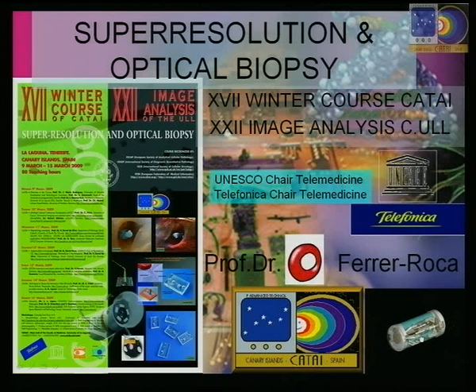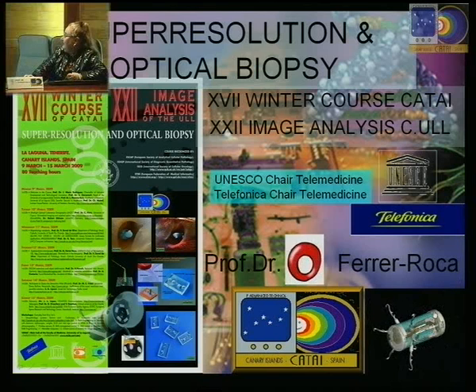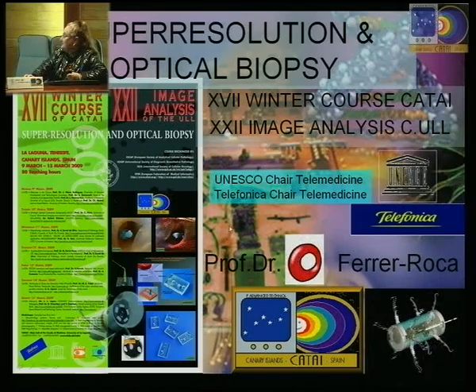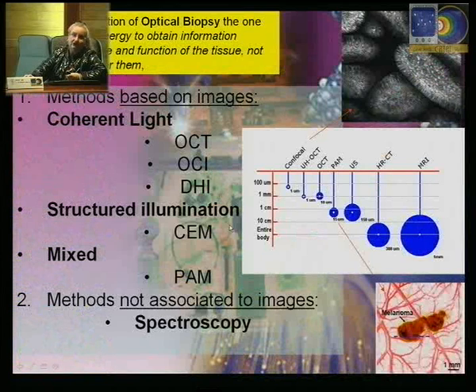Okay. In here, as you will see, there is an endoscopic capsule of the latest generation that has active moving, and that during the presentation we will see that it is also able to take samples from the tissue.